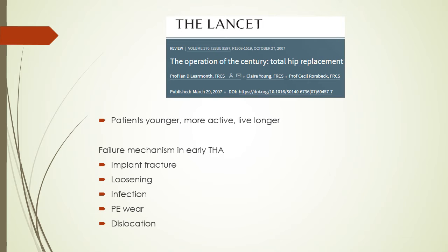So, back to the end of the introduction for the early history of the hip implants. Nowadays, we know that hip replacement is a very successful surgery in terms of patients restoring their functionality, relief of pain, and even forgetting that their joint is artificial. So that's really good outcomes. Looking at modern patients, we are seeing patients being much younger, more active, and living longer. So the requirements for modern implants are definitely higher than before.